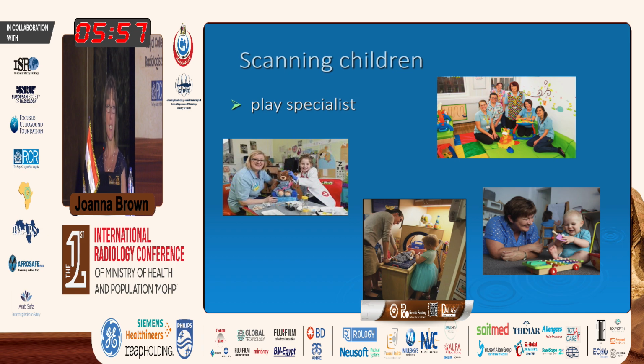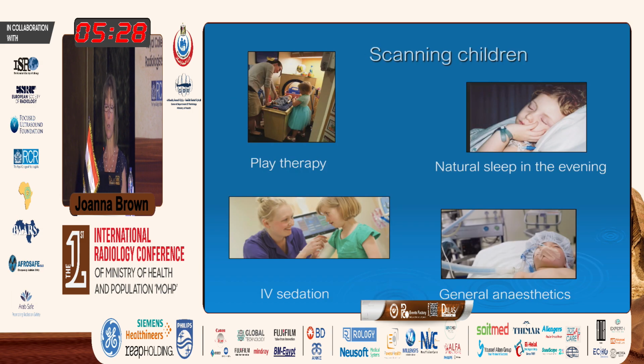We are really lucky in the UK that we have play specialists in our hospitals. So there are dedicated nurses and radiographers who look after the little patients when they come for scans. Very often before the CT or MRI, we bring the patient into our department about an hour before. They play with the nurses, who explain everything about our test, and then children tolerate the scan much more easily. So we play with them.